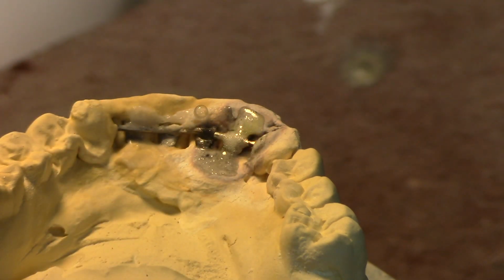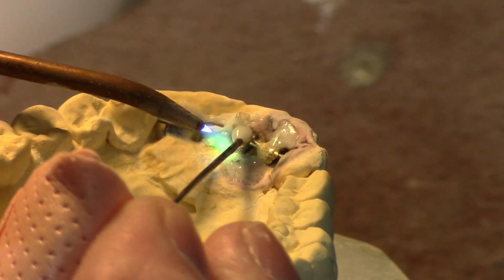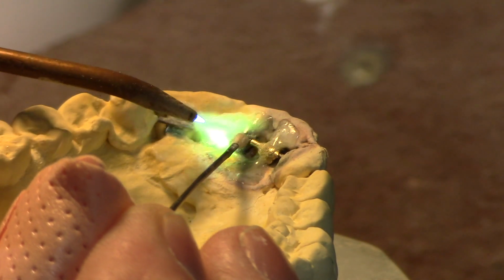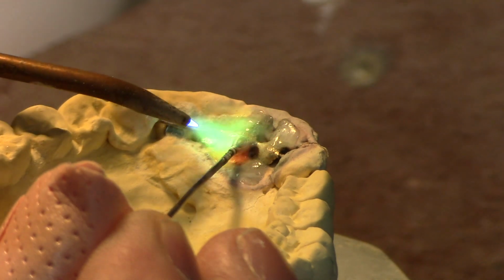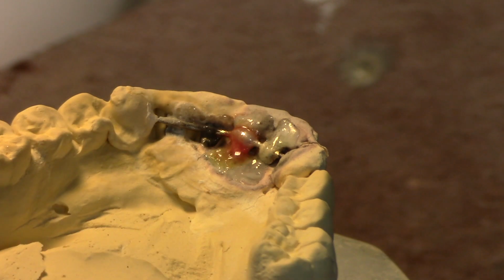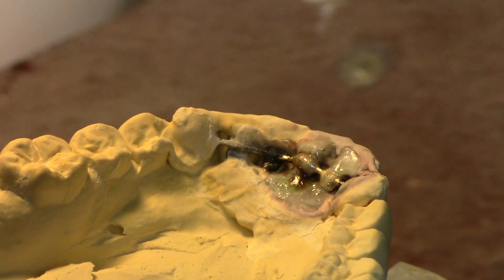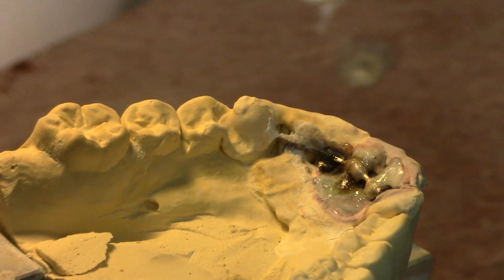Okay, there's one of them. So with this probe, it just makes it real easy, and with it anchored down real well with the stone, they don't move around. Just go from one to the next. I don't think I got that one real well. Okay, there we go. Can't tell if I got the pad on that one or not.